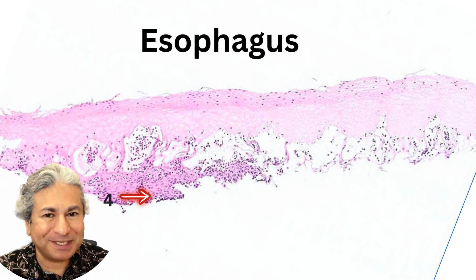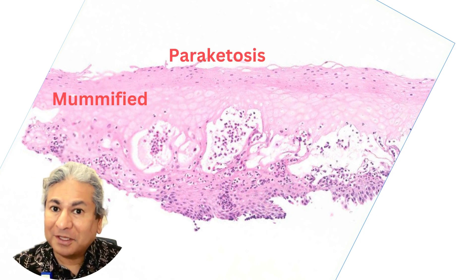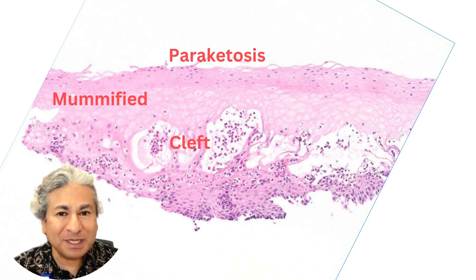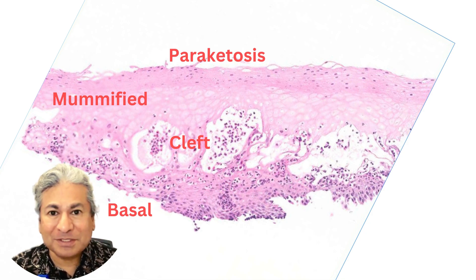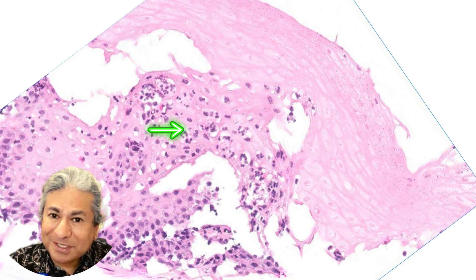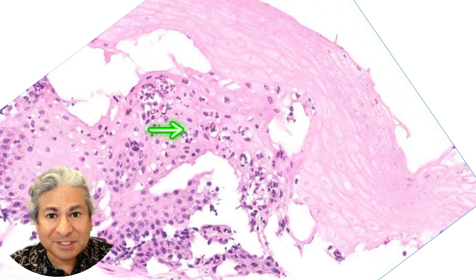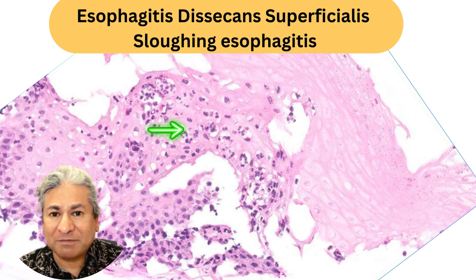So four layers: the parakeratotic layer, the dead or mummified layer, the third layer is the cleft, and the fourth layer is the basal cell layer. There are a few neutrophils in and around that cleft. The diagnosis is esophagitis dissecans superficialis, or sloughing esophagitis.